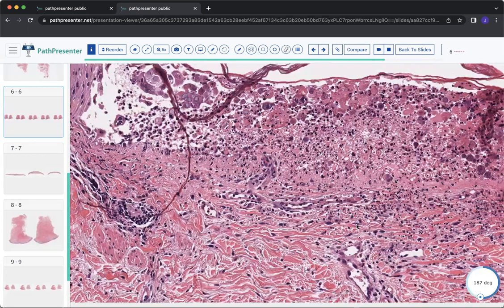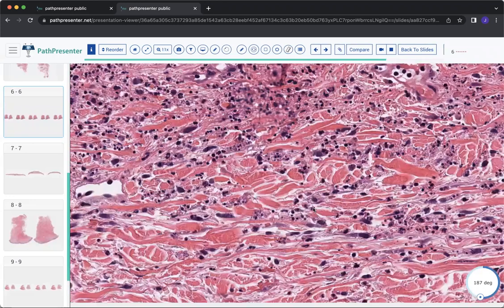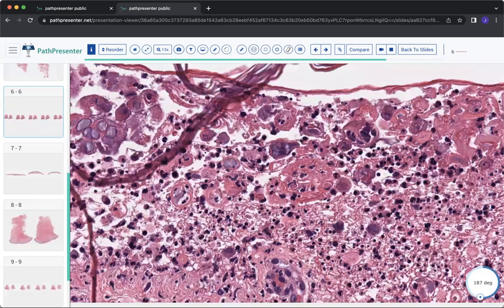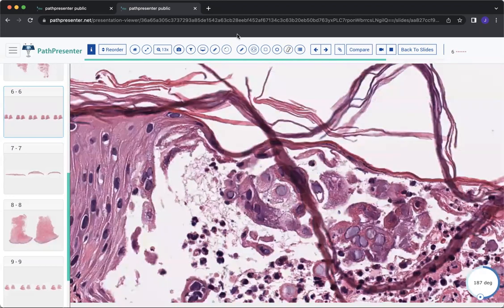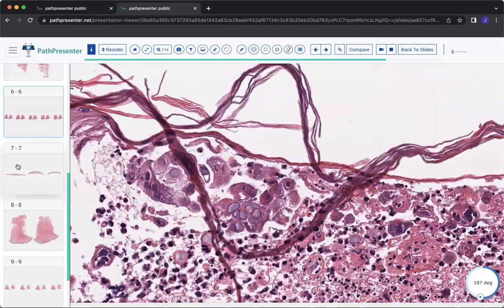So they shouldn't put anything about a bullous leukocytoclastic vasculitis in here if they just gave you this type of picture, but seeing the actual multinucleated giant cells, the viral infected cells, and how it changes the nuclear contours, that's going to be key for you to make the diagnosis. So that's herpes.